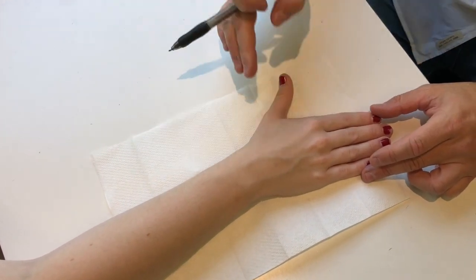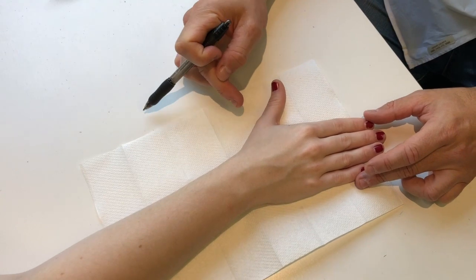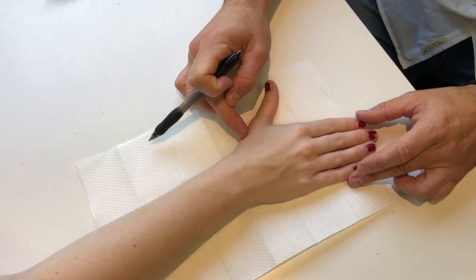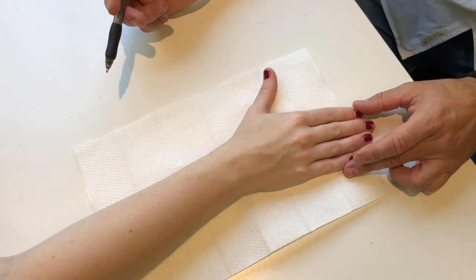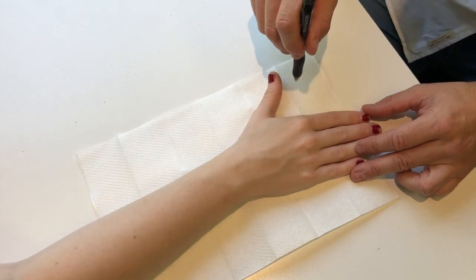You'd use this for things like De Quervain's tenosynovitis, base of thumb arthritis, and metacarpal fractures. They would be the main ones that I can think of now.